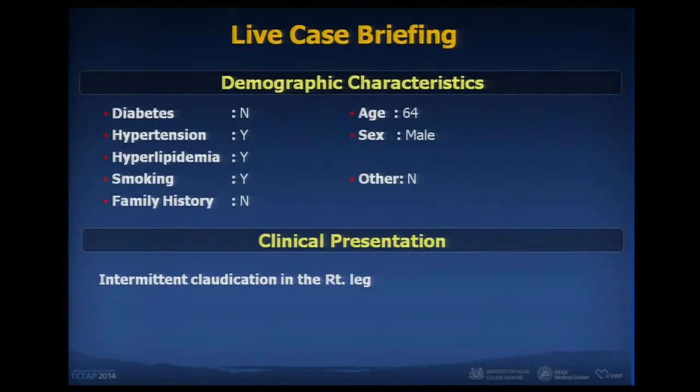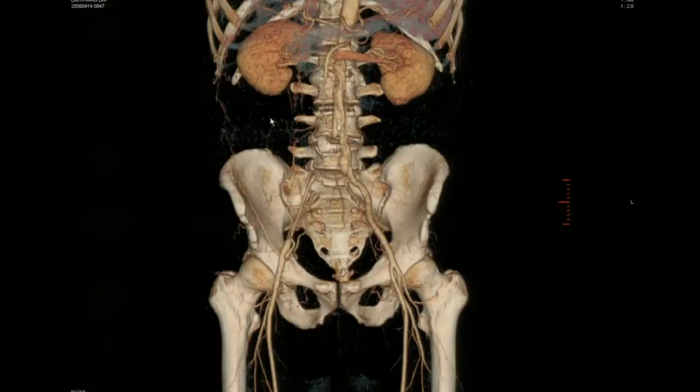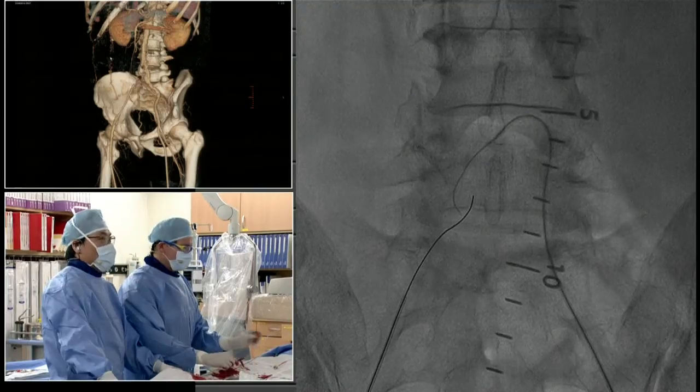And can you see the CT angio? CT angiogram would be good. Okay. Yeah, as you can see here, just the right common iliac artery proximal part is total occlusion. So as a CTO of the right common iliac artery, there's a diffusely narrowed right external iliac artery, possibly underfilled or possibly diseased. There's a high femoral bifurcation on the left side, it looks like.